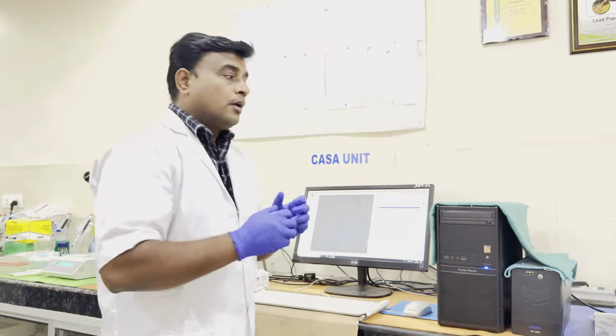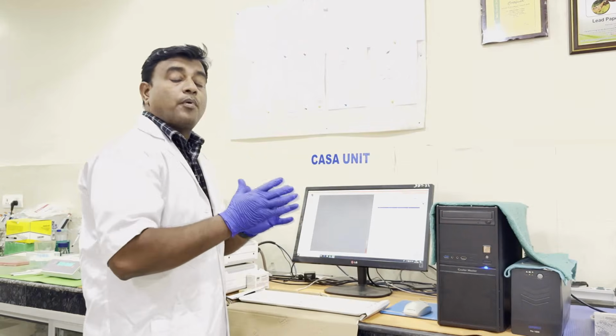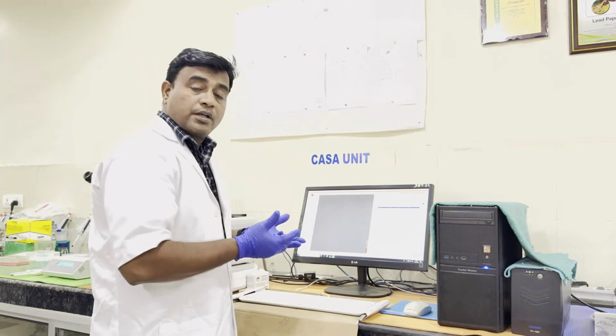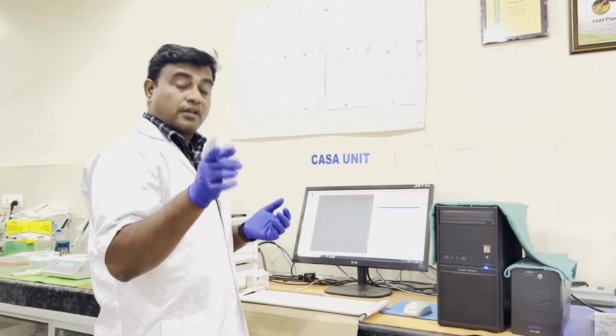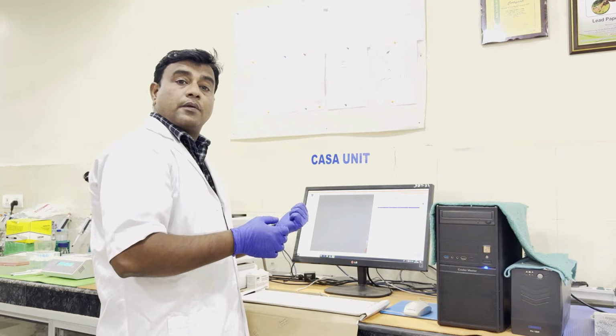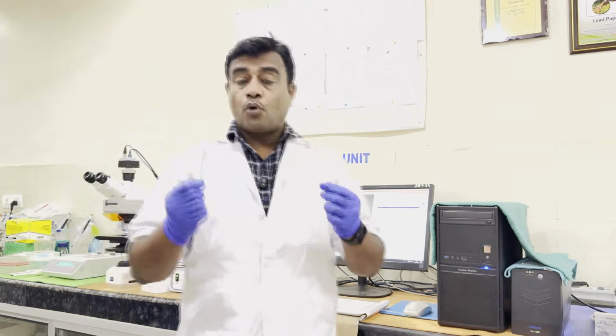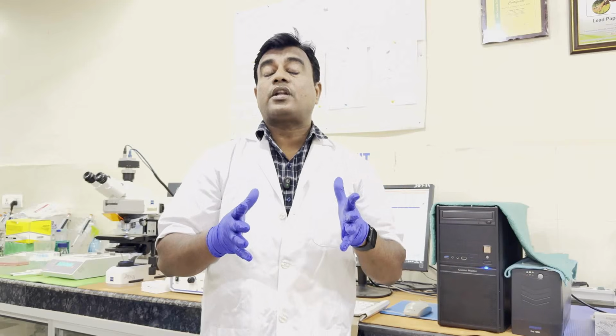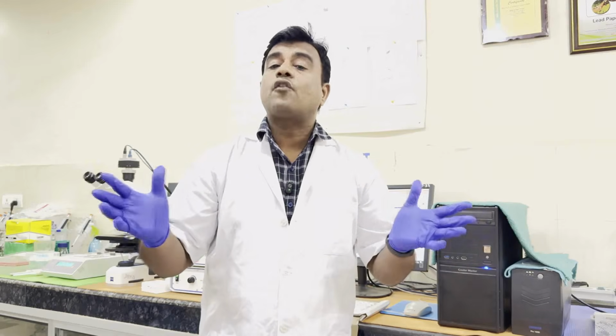So CASA depends on the type of software you are purchasing. If you require multiple parameters along with motion and kinematics, you can take these modules inside your CASA. Using fluorescent probes as per the manufacturer's instructions, you can record the values and CASA will automatically analyze, just like a flow cytometer.